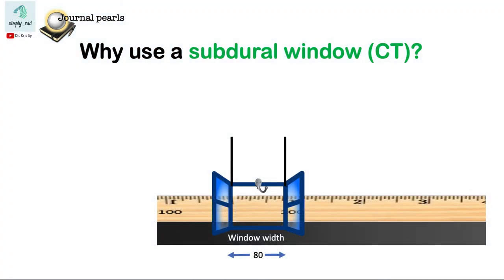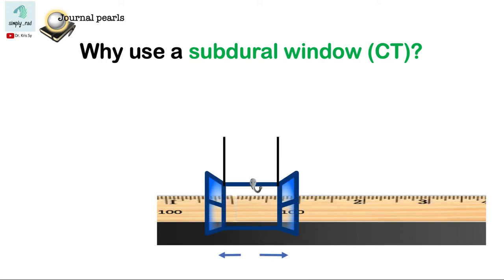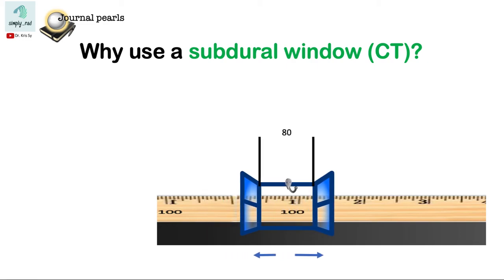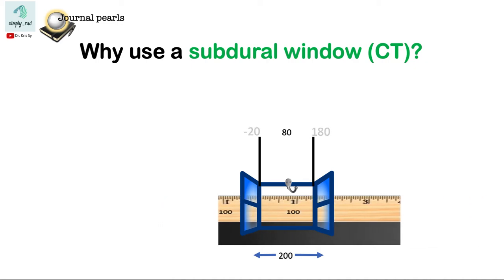So what we do here is that instead of the brain window with a width of 80 centered at 40 Hounsfield units, we're going to slide it up to a center of 80 and set a wider width of 200. Now the range of Hounsfield units are changed. It's 80 minus the half of 200 which is minus 20, while 80 plus the half of 200 is 180.